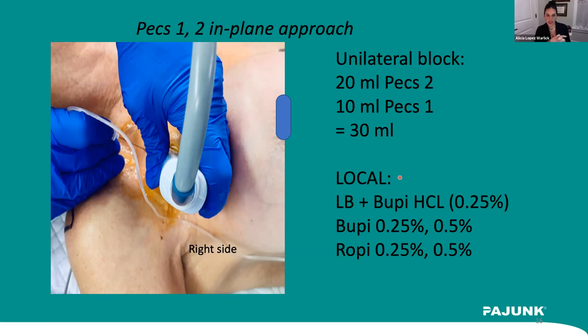I recommend that you get your confidence up by first starting with placing blocks asleep in patients, okay? Because I find that when people first start with patients that are awake, it's sort of unnerving to have a patient that is very anxious and you are trying to block them, and it's sort of not ideal conditions. So if you get a chance to start up your block service or your ERAS protocols and you're training people to place these blocks, I can recommend starting asleep in the operating room if you can possibly do that, because you get just more time to look at the structures and you don't have to worry about the patient that is anxious. Okay.